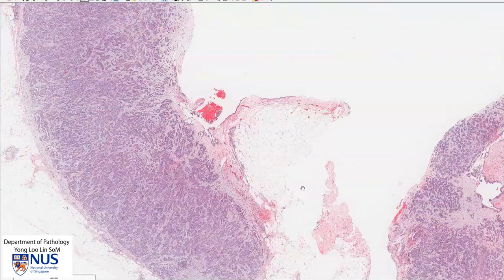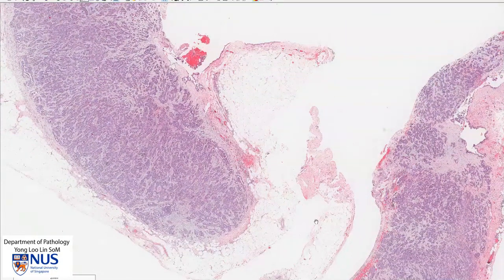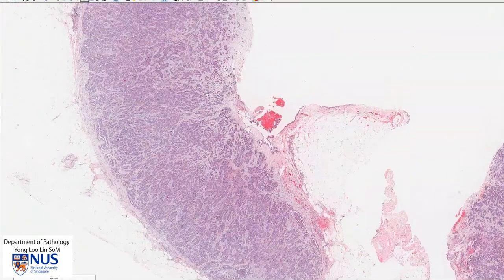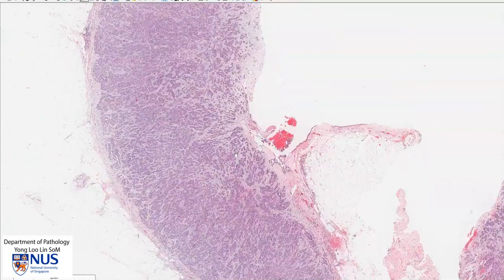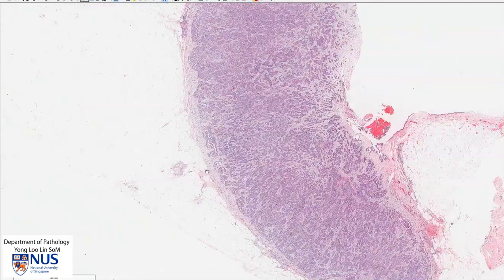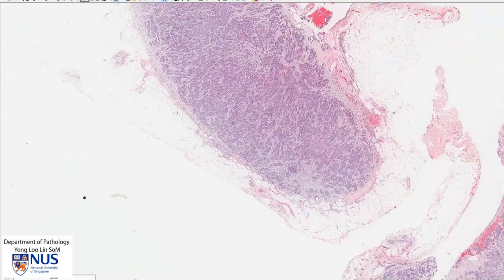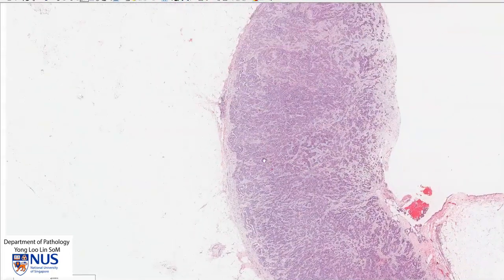In this particular specimen, we do not see any skeletal muscle. This is the area that is involved by the tumor, and we can see that the pleura is very markedly thickened. Sometimes we are also able to see these malignant mesothelial cells infiltrating into the adipose tissue or even into the skeletal muscle of the chest wall, but in this particular case, we don't see a very obvious focus of invasion into the fat.